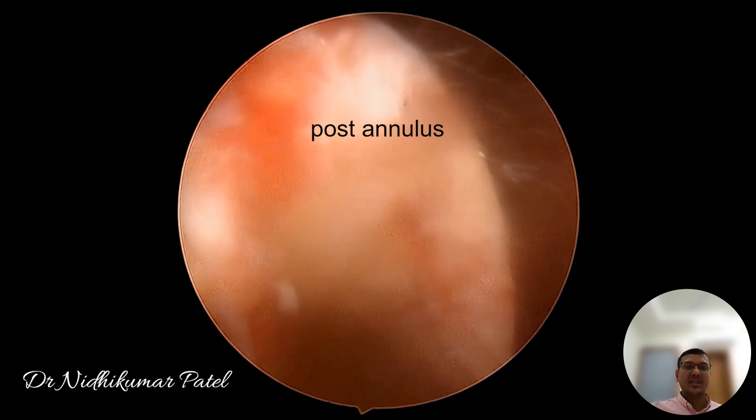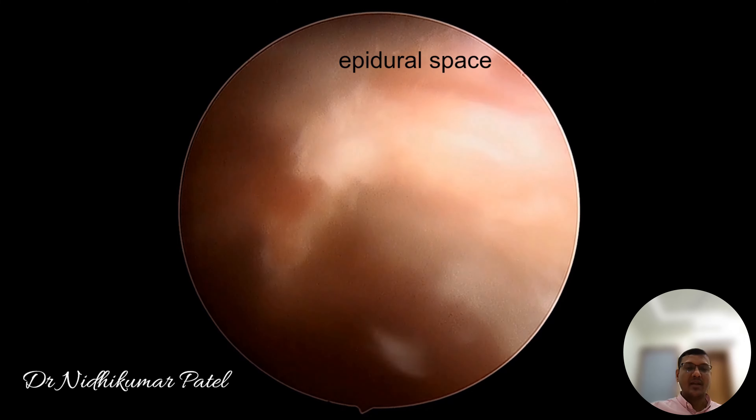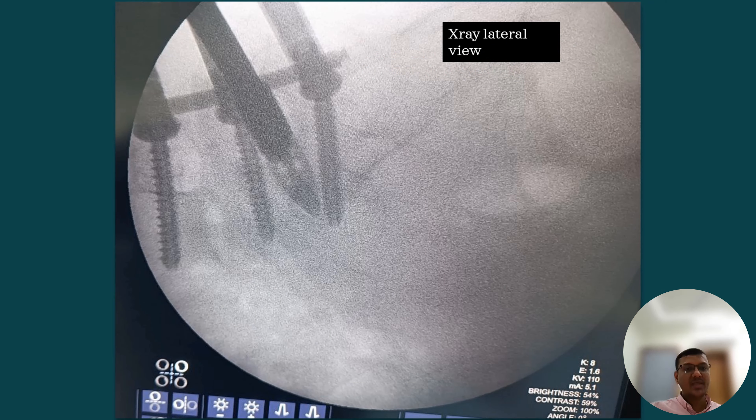Here is the posterior annulus and the epidural space. Then we remove the scope, pack the bone graft mixed with bone marrow because we don't have local autograft, then remove the cannula and give the guide wire inside the space. Over that we insert the cage, and once it engages in the space we remove the guide wire and hammer it down until its final position is achieved.